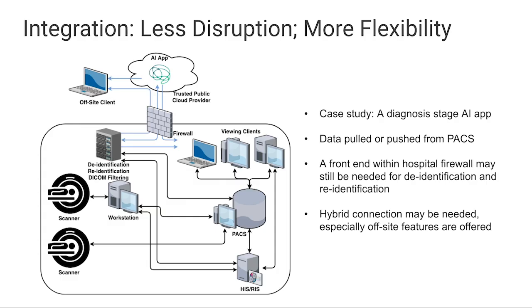At the current stage, most diagnostic AI apps still need to interact constantly with the radiologist, because at this stage, both the market and the regulatory bodies don't really buy into the concept that these apps can provide very reliable, very explainable diagnostic endpoints directly to patients. So radiologists still need to approve and review these results being produced.